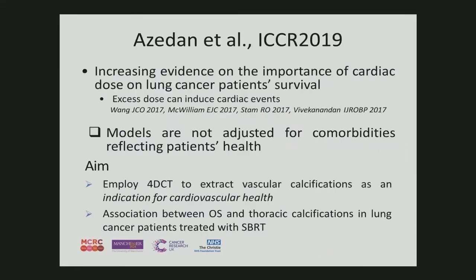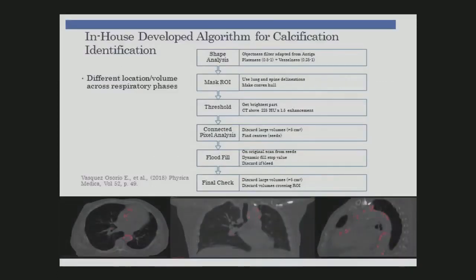Another example is of course cardiac health. How do you measure cardiac health? One way of doing that is looking at plaques in the vessels, which are indicated by calcifications. Old plaques become calcified. So go and look in CT scans where the calcifications are. Now, normally, it's very small. Normally, you do this on specific scans made for this purpose. But we are doing it on 4D CT scans made for treatment planning. 4D means they're a movie loop over a respiration motion.